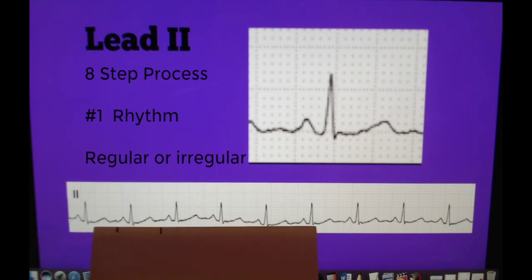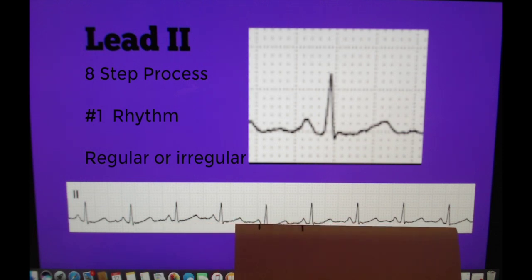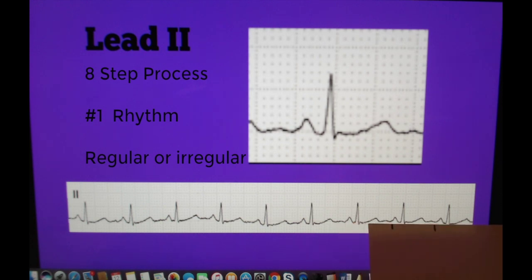Second we are going to look at the atrial rhythm and do the same thing. And we can see here that we also have a regular atrial rhythm. So for step one, both atrial and ventricular rhythms are regular.